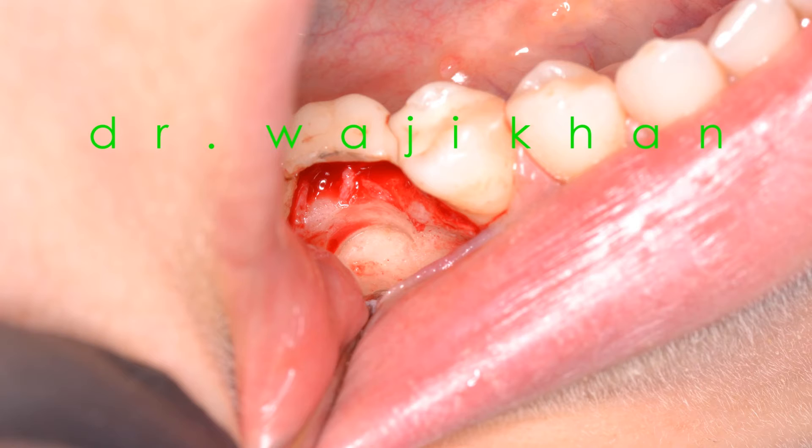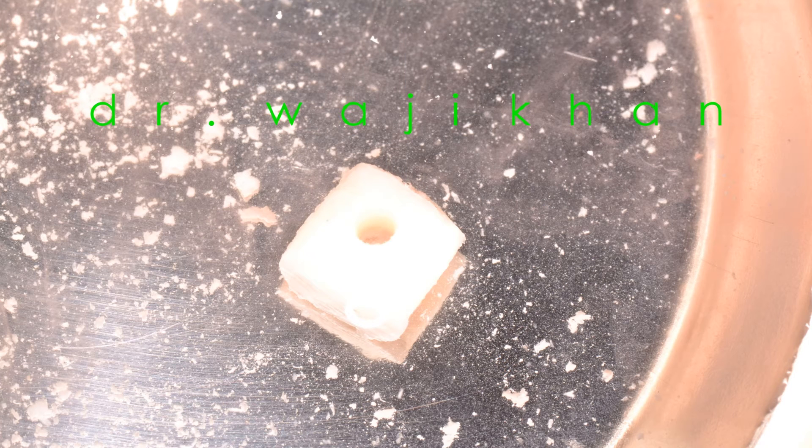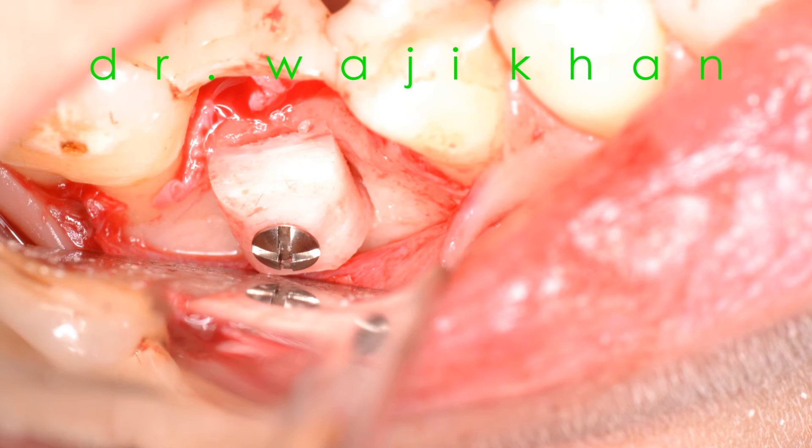We use the preparation burr to make a notch inside the coronal third of bone. One issue here is that we didn't pierce the cortical bone initially, so I needed to use a few other burrs to pierce through the cortical bone to get bleeding from the cancellous marrow required for adequate healing. We then take the prepared bone using a 702 burr, which allows a passive fit of a screw through the channel, prepare the donor site, and using a lag screw technique engage this piece of bone into that area.